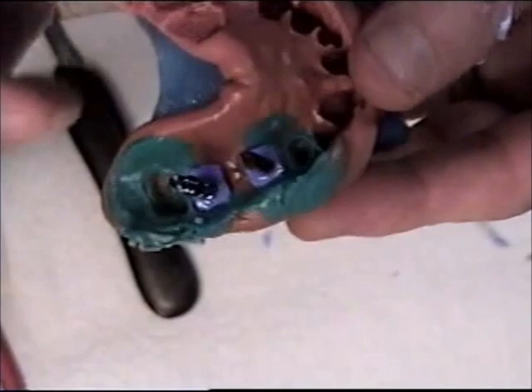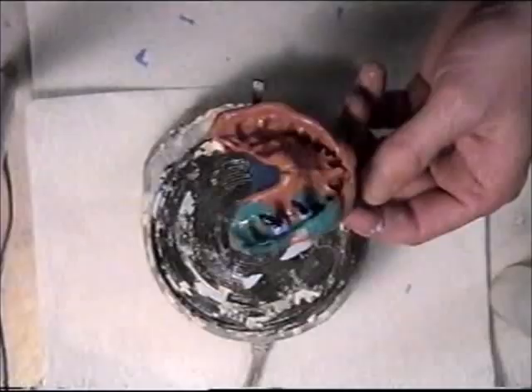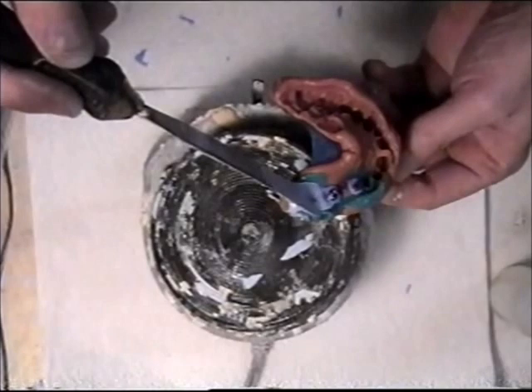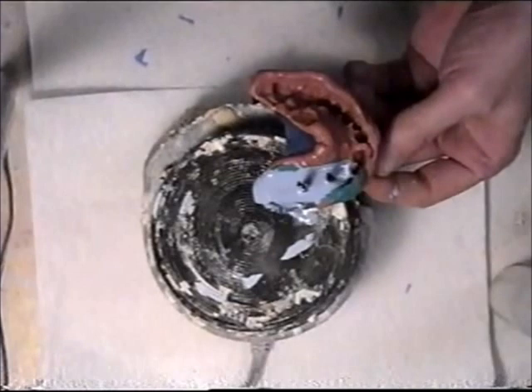So what I'm going to do is blow a little bit of the excess off here, little pieces like this, and I'm going to get ready to pour my die stone into this impression and start making my working model. Start in the back. Just vibrate around the analogs. Pour this up like you do a regular impression now.